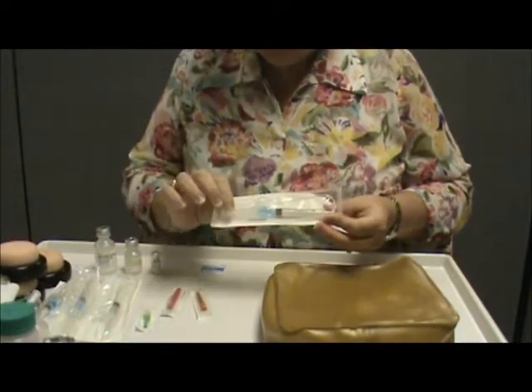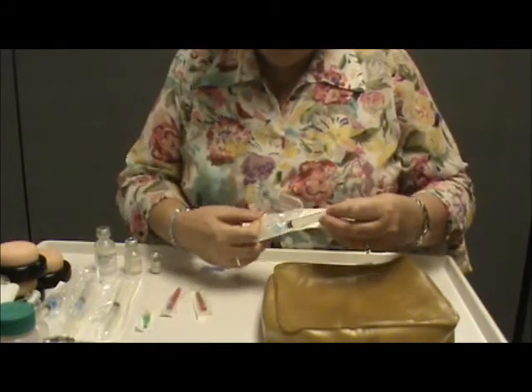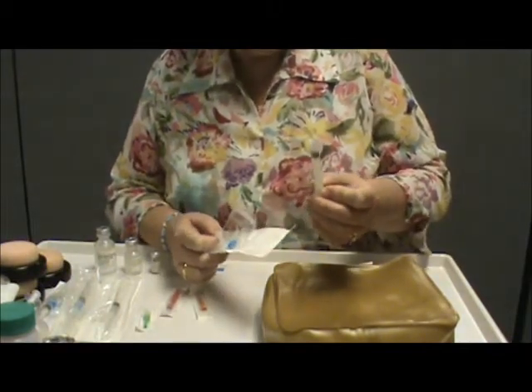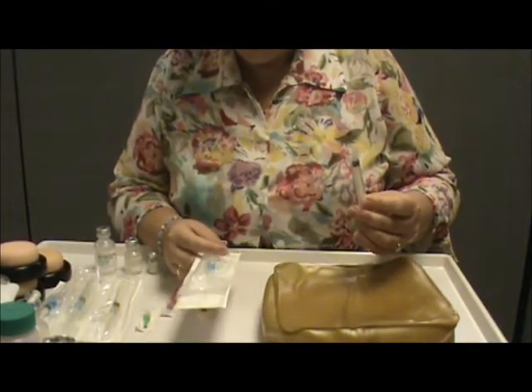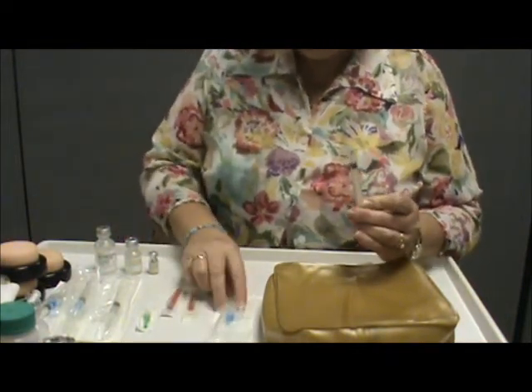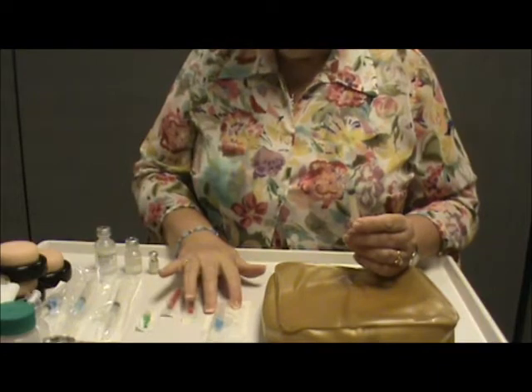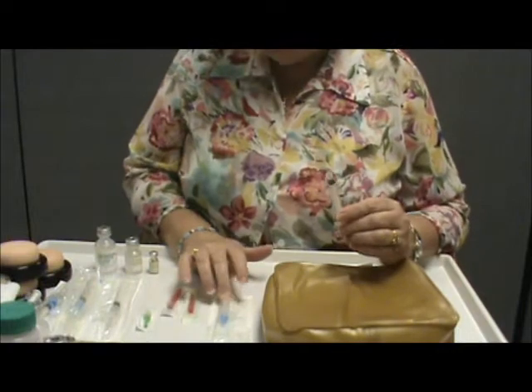In the case that it comes with your syringe attached, go ahead and open it, pull your paper back out of the way, hold your needle in your package, pull your syringe out so that you don't contaminate the tip of your syringe, and then leaving your needle in here will keep your needle sterile. You generally want to avoid using a sharp anytime you can, so as you're filling your syringe, working at the med cart, then you want to work with some type of a blunt and save your sharp for the bedside.